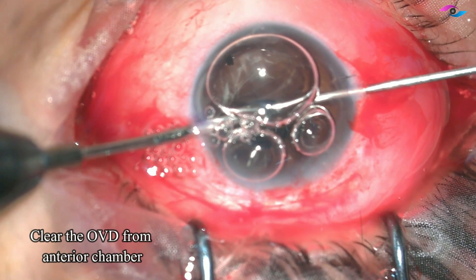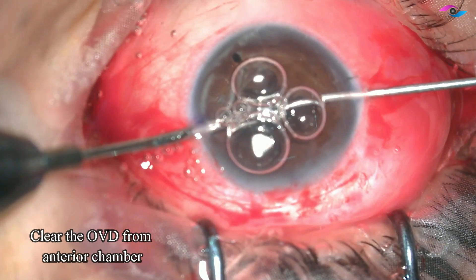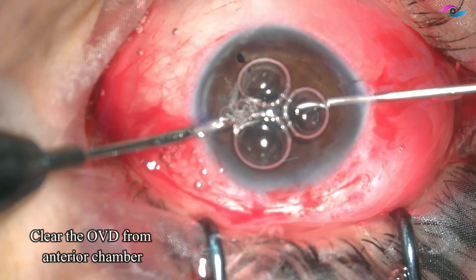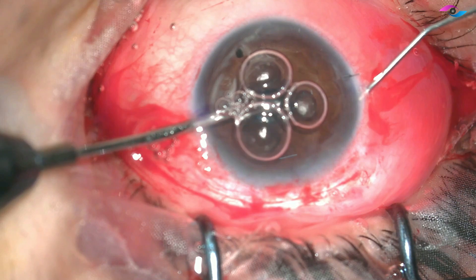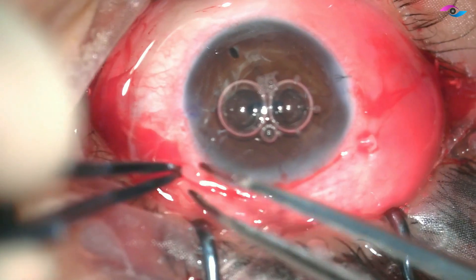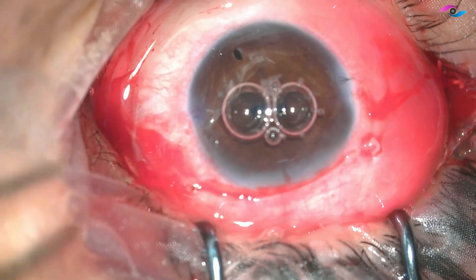Clearing all the viscoelastic would prevent intraocular pressure rise post-operatively. After this is done, I remove the cannula and before sealing the incision I am hydrating with the cannula, then sealing all the incisions and using cautery.